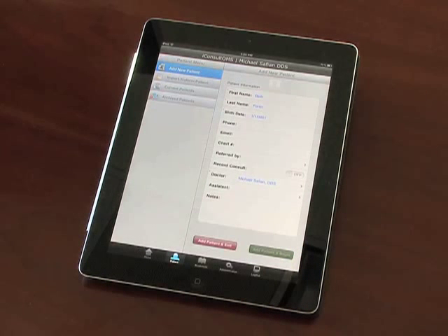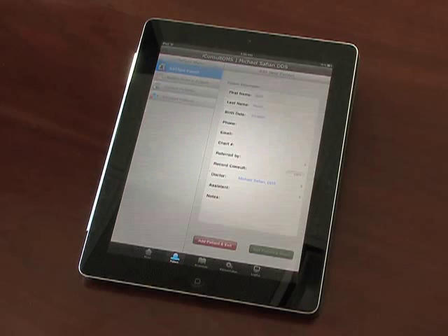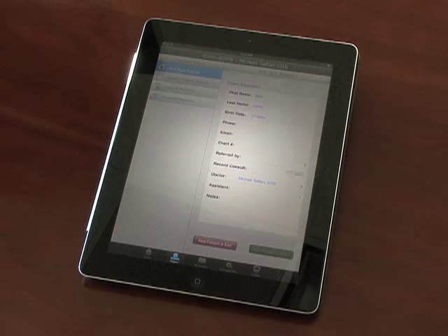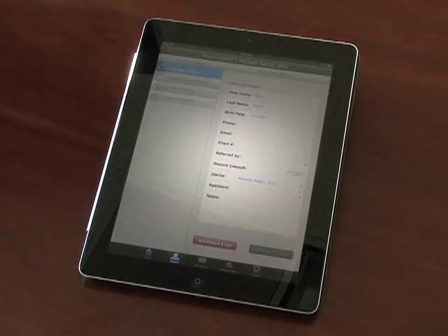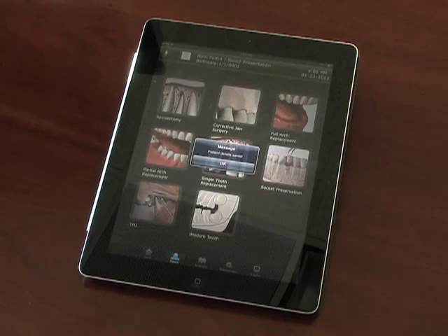Once you've finished creating the patient's file, hit the green button to save your progress and move on to the next screen.